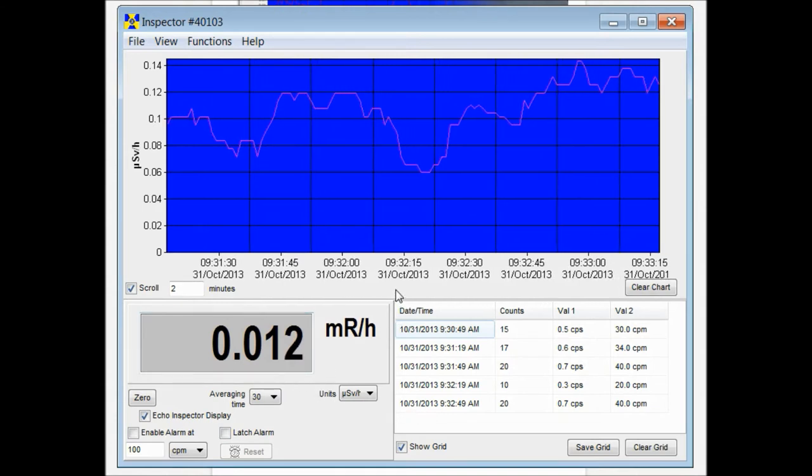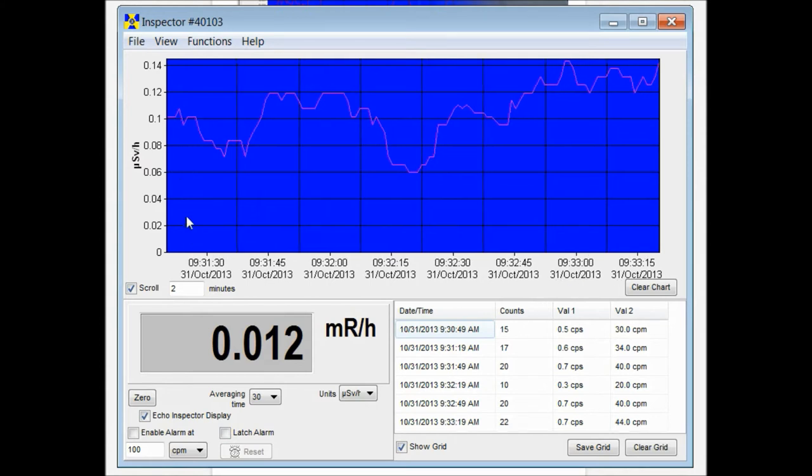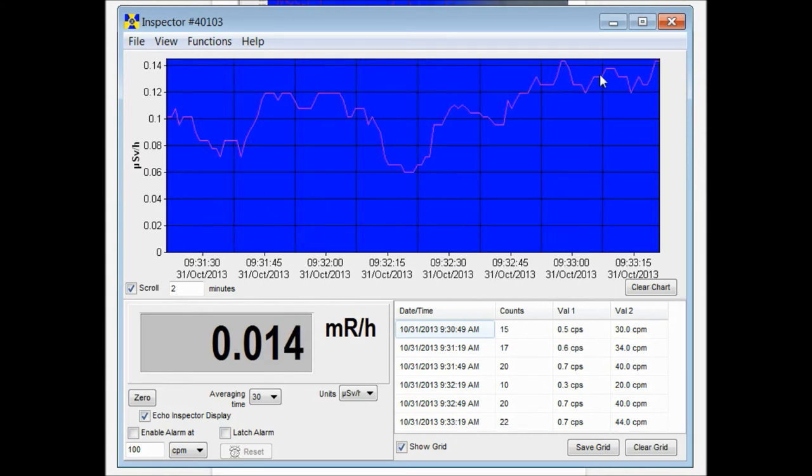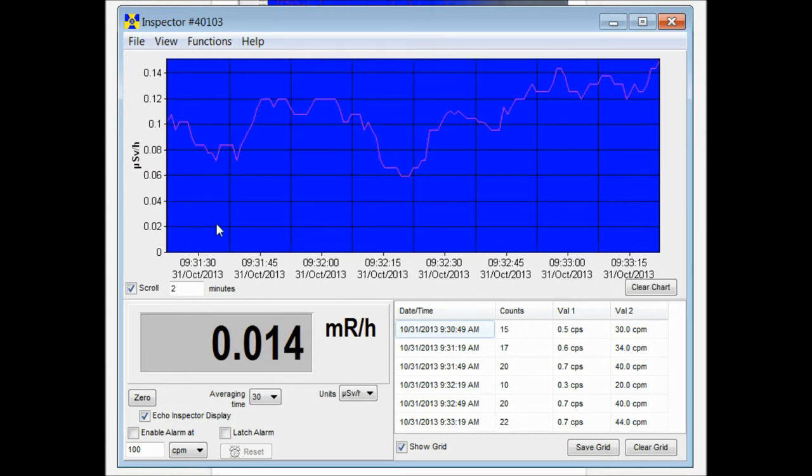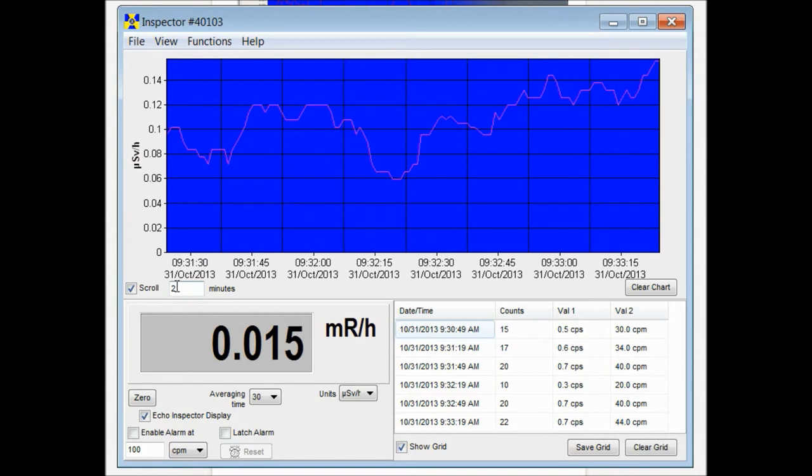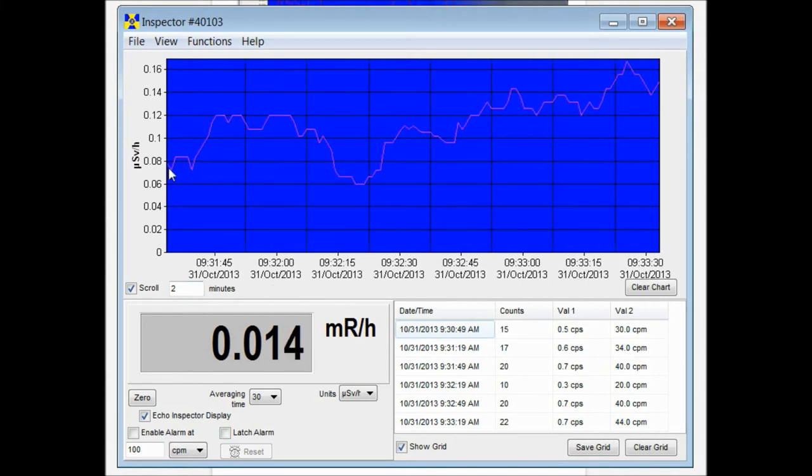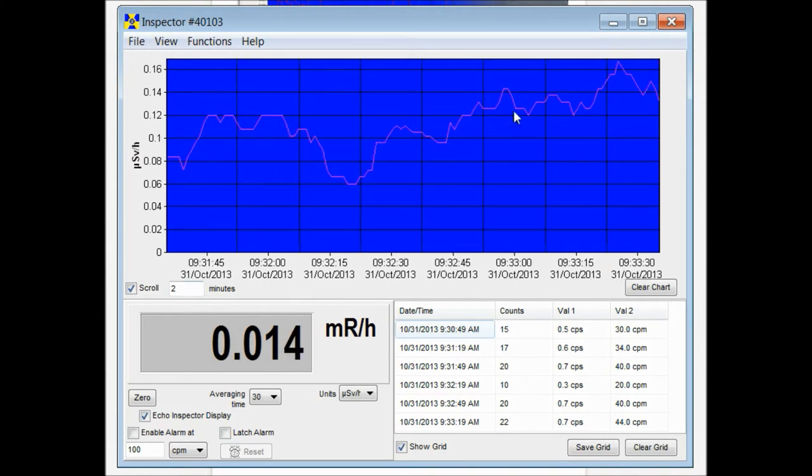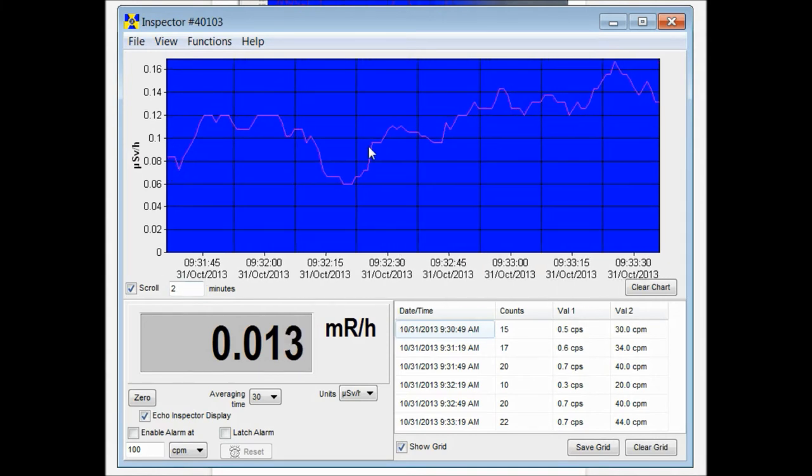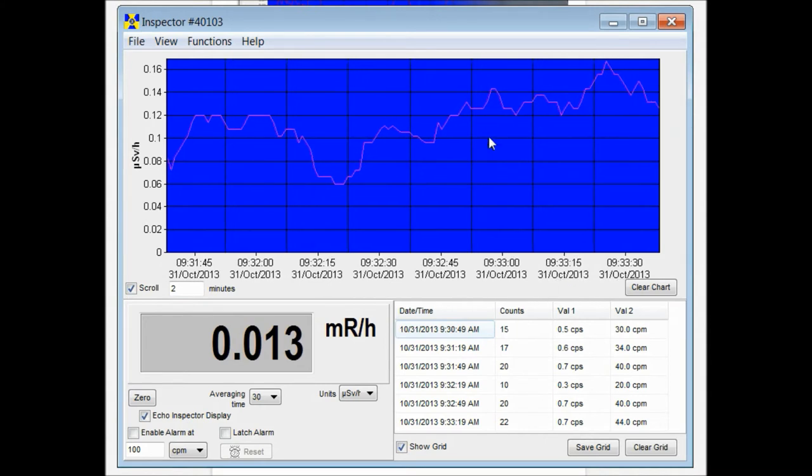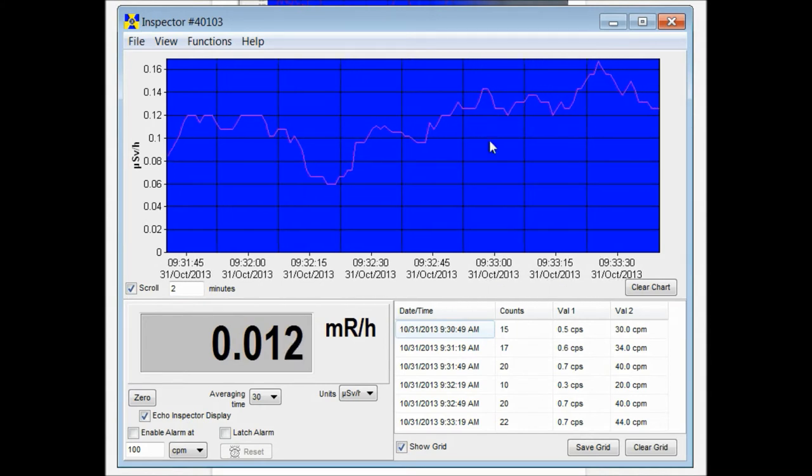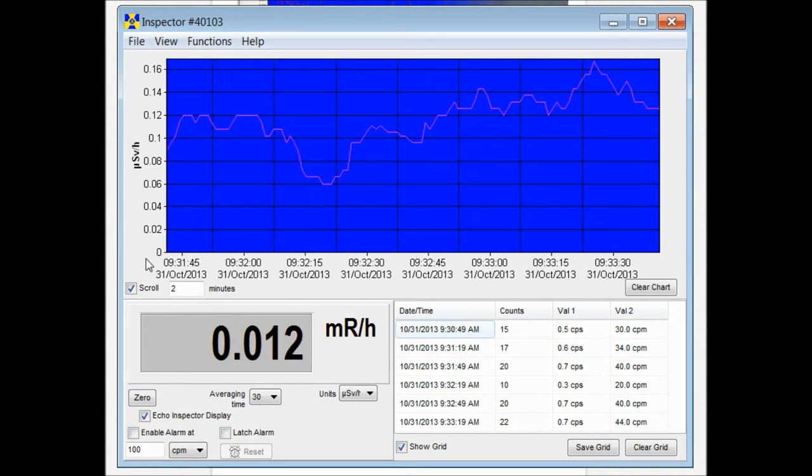Now we've been collecting data for a little bit. I can show you the scroll feature. Up here you have a window that by default is set to two minutes. So right now we're seeing the most recent two minutes collected off of your device. This is a live reading that it's collecting while it's plugged in.